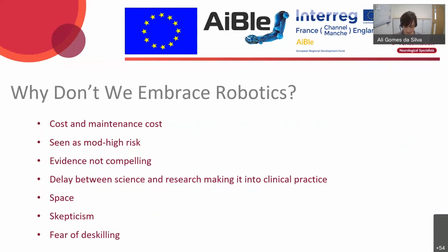So robotic therapy is not really a new thing. It's been around for quite a while. It's actually been written into the stroke guidelines in the UK that we should be considering robotic therapy. So why don't we embrace it more? These are just, again, from my own experience, the reasons that I've come up with.